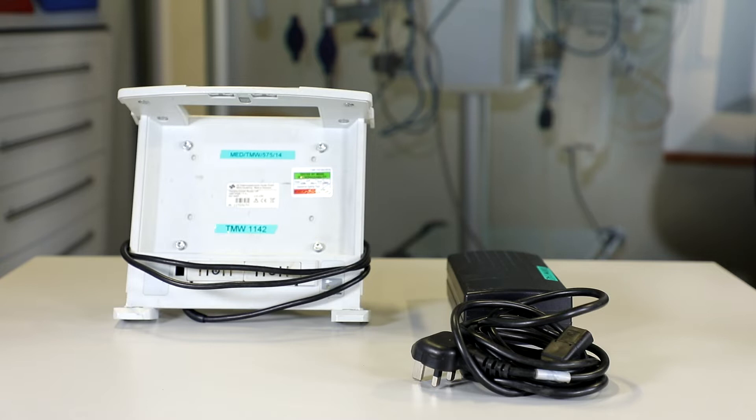The last physical checks we need to do are to check the transformer and the bracket. We check both of these for any dirt and damage, check the TMW asset number is matching to the other components, and then check that the MDSS serviceability sticker is in date.